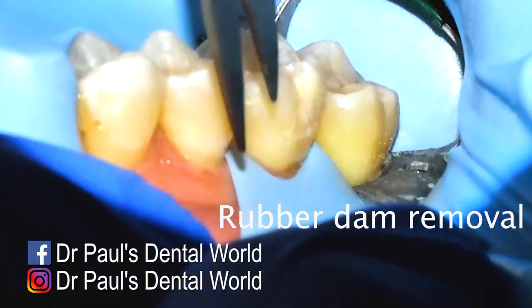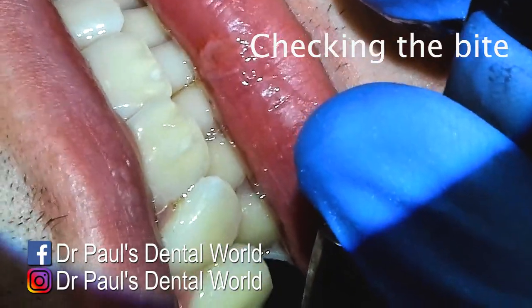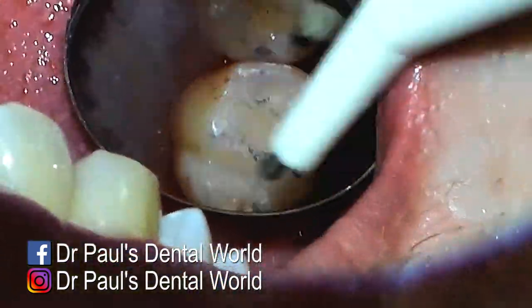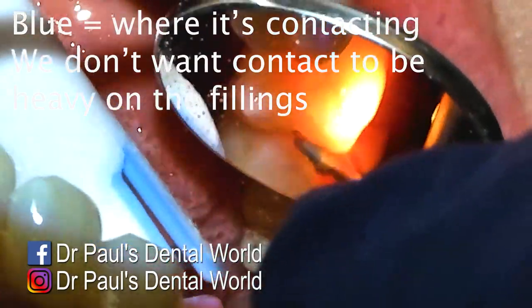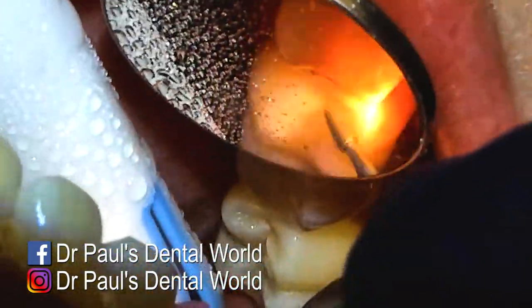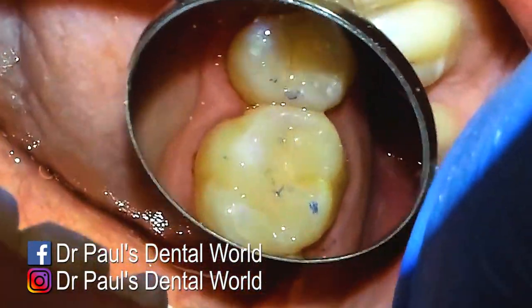Next is to take the rubber dam off. My little trick: I'll cut it with some scissors to take the rubber dam off, so it doesn't flick each time you pull it out between the teeth. Then we check the occlusion and we do have some adjustments to make — there's some contact on the teeth next door, you can see that with the blue marking. Those contacts mean that I'm close so I don't have to do too much adjusting, but I do have to do some.